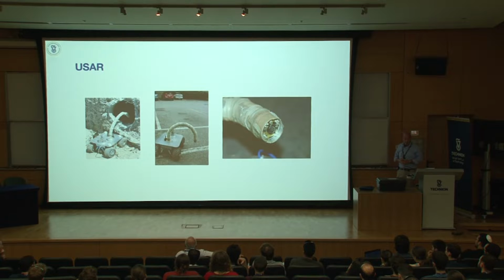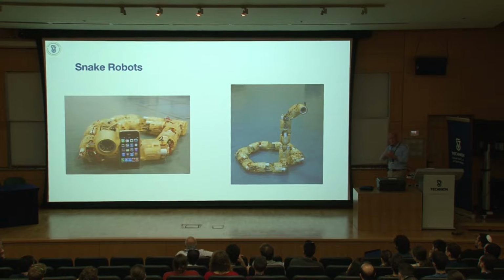At some point, we took these robots and disconnected them from the base, and this was already done here at the Technion, and the result were snake robots that crawl and roll within the lab. They're untethered, they're fully controlled by algorithm embedded in the snake itself. Computation is on board, energy, communication, everything is on board.